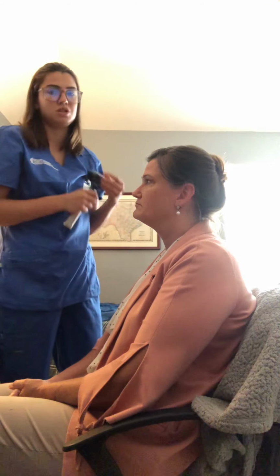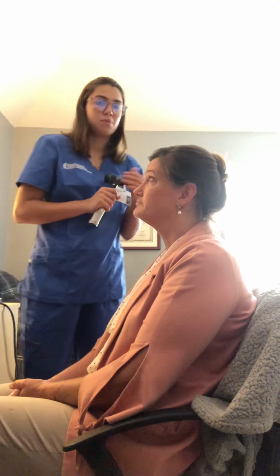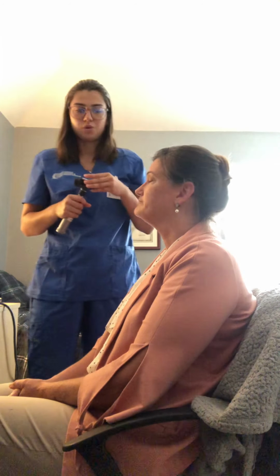I'm also making sure to observe the cone of light, which is the reflection of the light on the tympanic membrane. So both membranes look clear and good, no perforation.